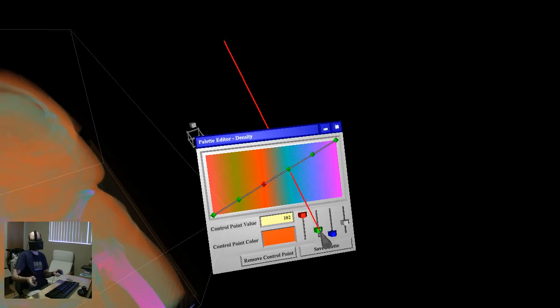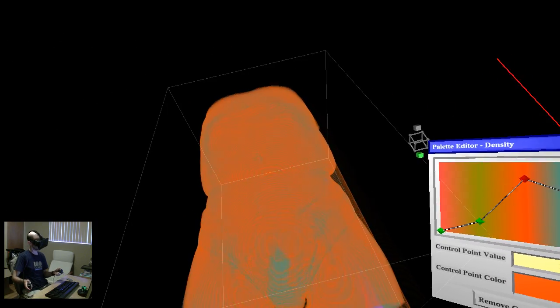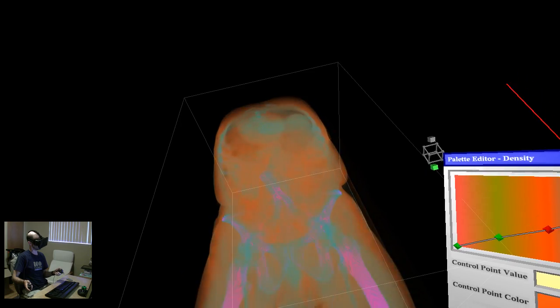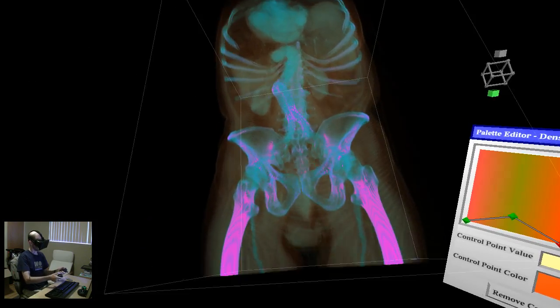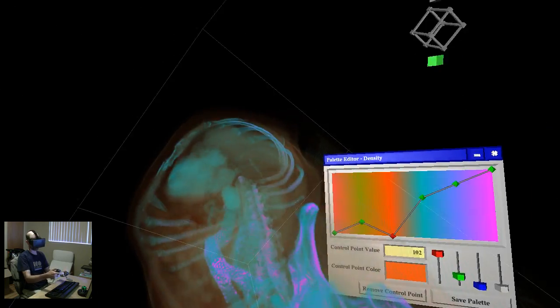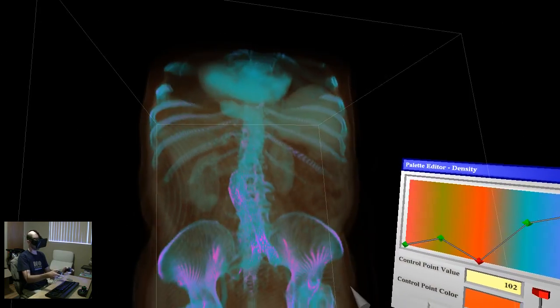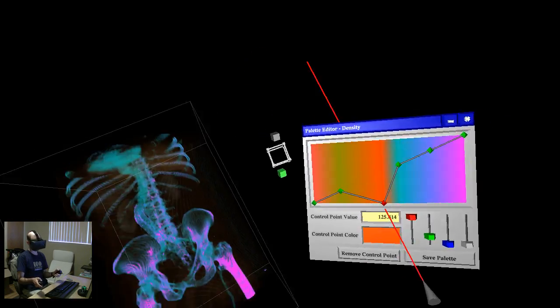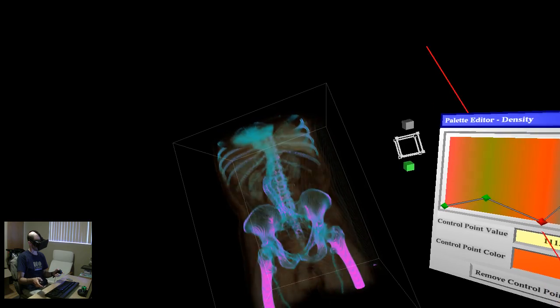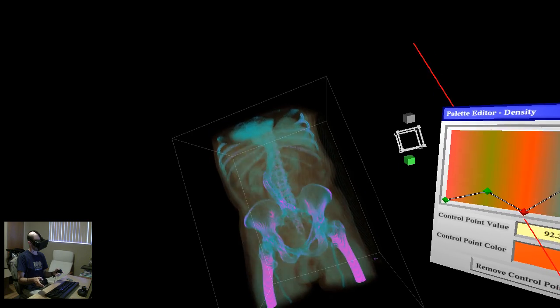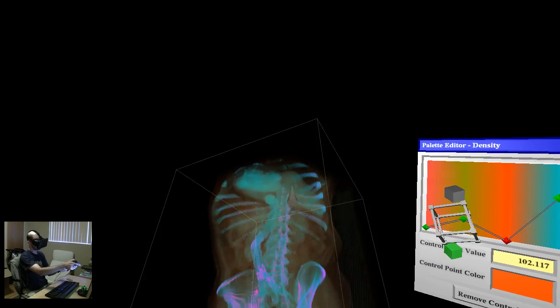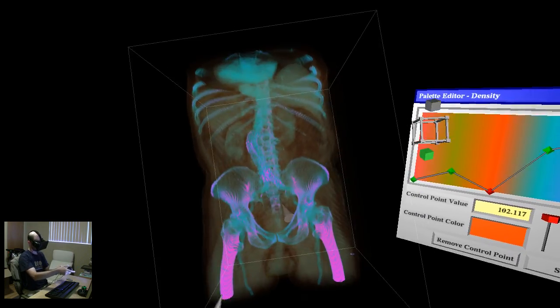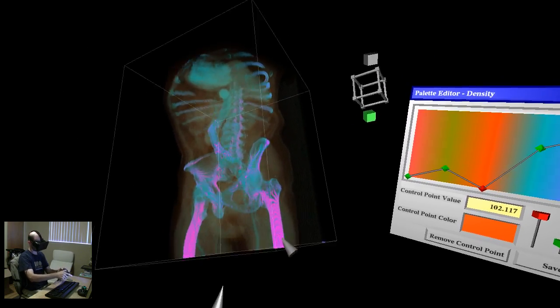So I'm going to drag on this slider and I can make it very opaque, in which case I see really the soft tissue. Or I can make it completely disappear, in which case I'm now seeing the skeleton behind the soft tissue. But still I have this faint aura of the soft tissue just to give me context where things are in this patient. I can drag the control point to the left and to the right to get the same color assigned to different parts of the data. This here is pretty good. So you can see there are the kidneys. Here's the heart. The lungs don't show up because they're full of air. And the bones show up really nicely.